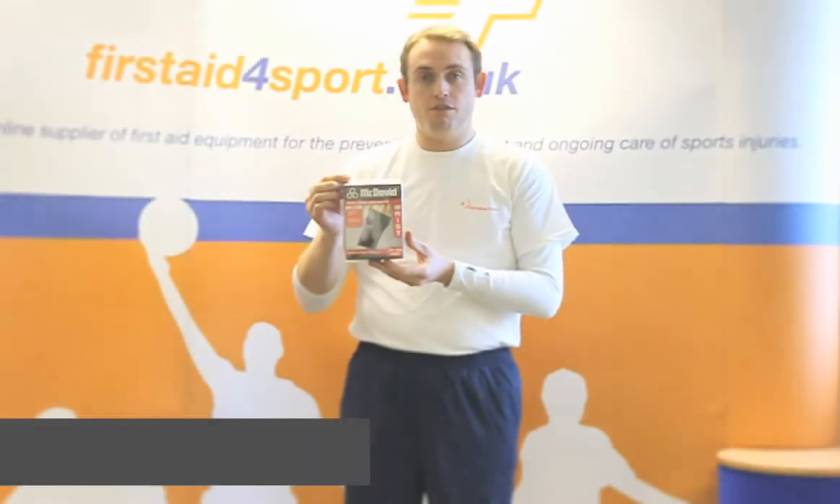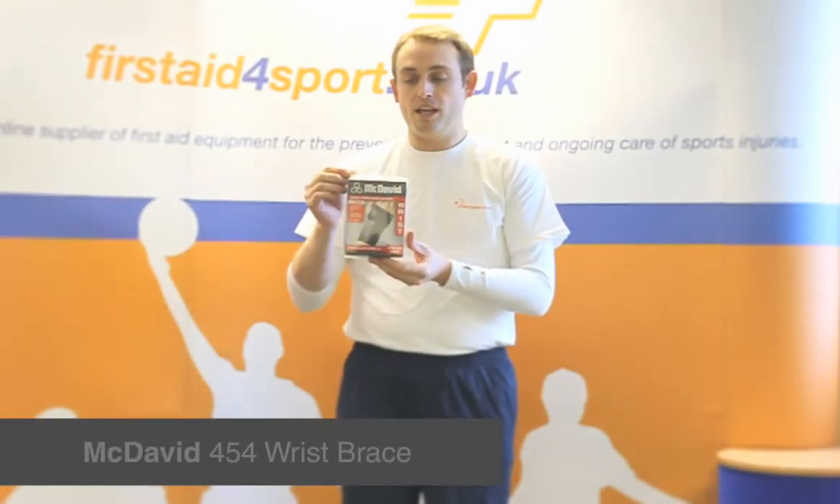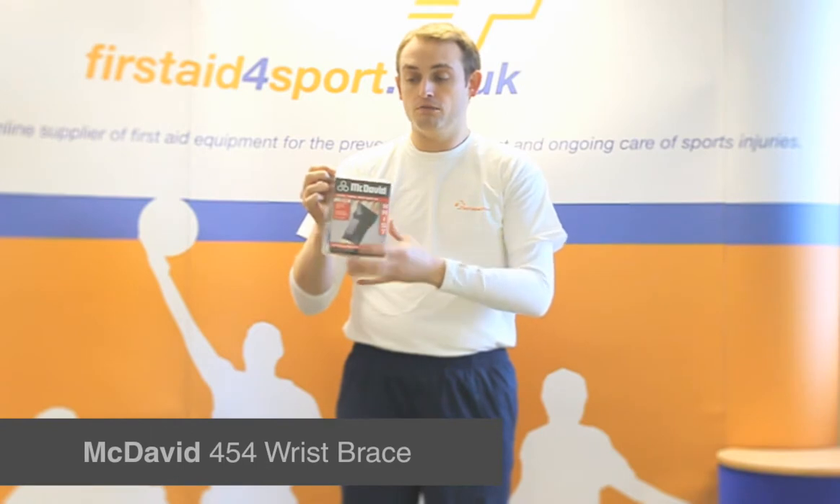I'm Michael Davison, Managing Director of First Aid for Sport, and this is the McDavid 454 Carpal Tunnel Wrist Support.